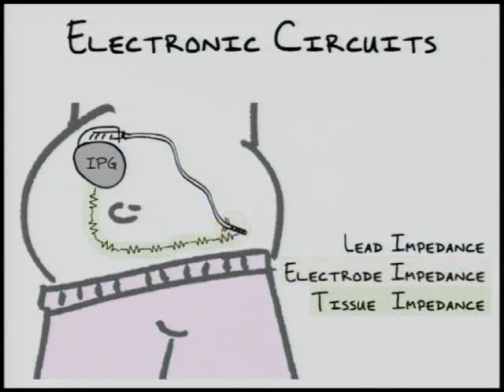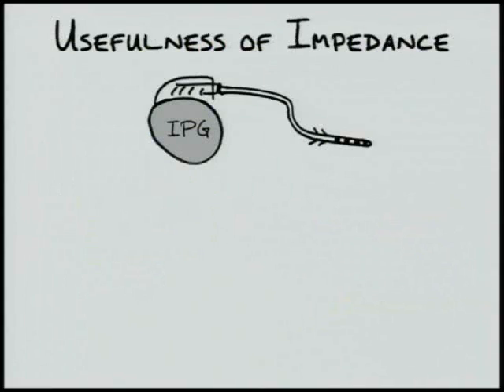The third impedance, integral to neurostimulation, is tissue impedance, which, as mentioned earlier, is simply the resistance to flow ions encounter as they move through cells and the extracellular space from one neurostimulator electrode to another.